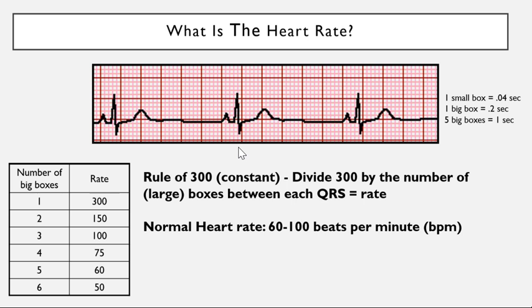What this PowerPoint and test questions are going to be is, the first one is determining the heart rate. You're going to have a heart rate question, and you'll see this on the practice test as well. Then I'm going to give y'all a whole bunch of different arrhythmias, and y'all just have to generally identify them. The other 4 questions are going to be, here's this thing, what is it? And different variations of that, pretty much.